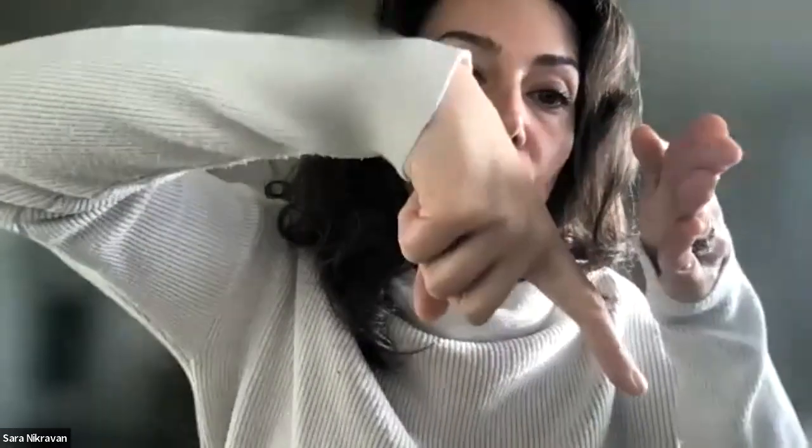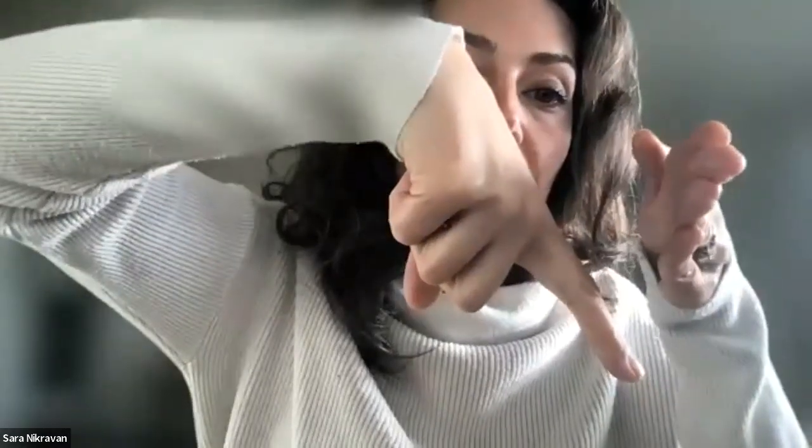The reason why is because I want to keep a shallower angle for the femoral. Because if you go steeply with the femoral wire, then you're going to be going through all this tissue and trying to dilate it and put your catheter in. And oftentimes with a bigger catheter, let's say you needed to put a cordis, you end up bending the wire because you're trying to do this and your wire's like this.